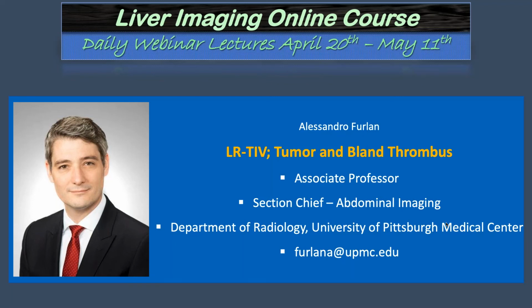I know that Claude touched base on this on Monday, but if you clearly see the enhancement and washout, then you would use the LI-RADS 5 category. But if you don't, those would be categorized as LI-RADS M. It's a challenging situation, but again, to preserve the high specificity of the LI-RADS TIV category, if you don't see the enhancement, but you see the continuity, the expansion of the vessel, and the restricted diffusion, you're going to suggest the diagnosis without being definitive.